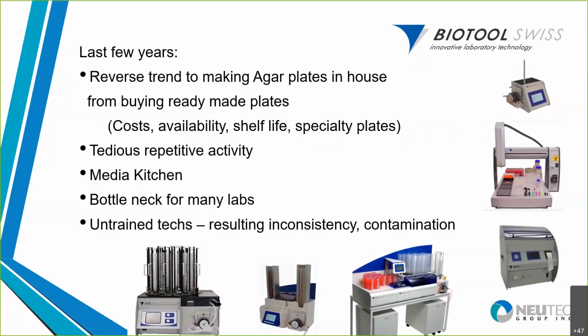over the past years, there's been somewhat of a trend to try and simplify this process by going to where you can buy these media that have been pre-poured. So you can buy them like a consumable, these ready-made plates, and then use them and do your inoculation, and it saves you this process of having to create your own media.